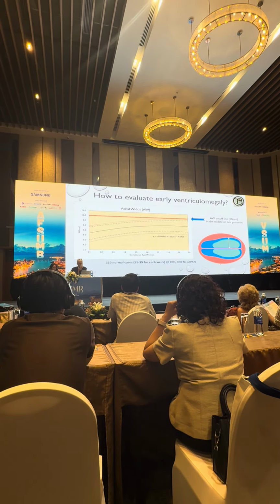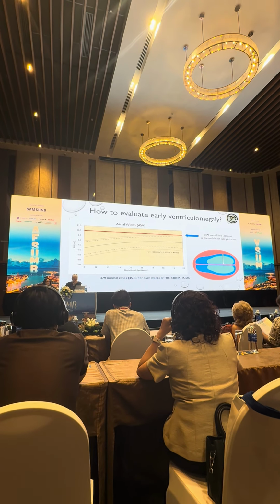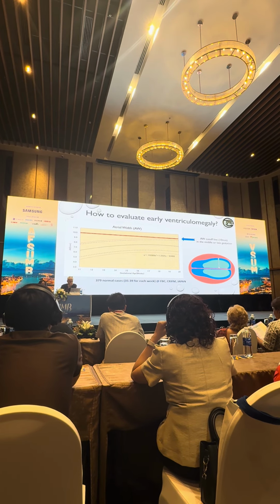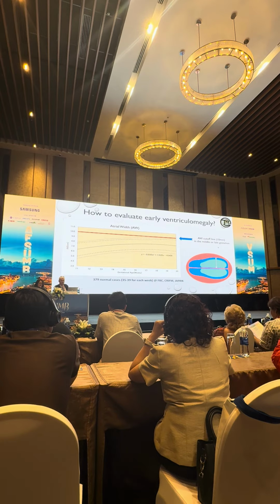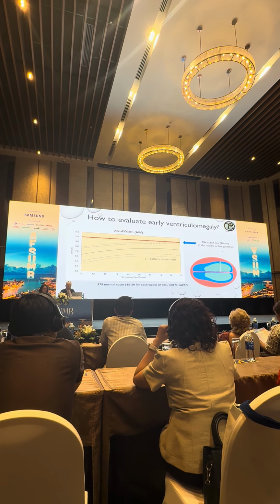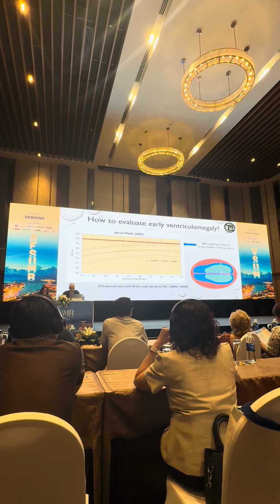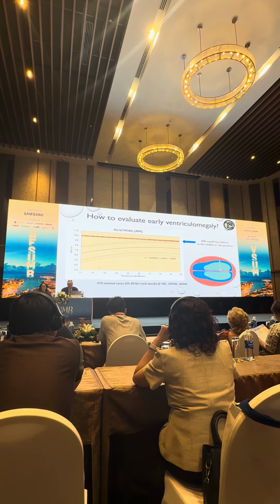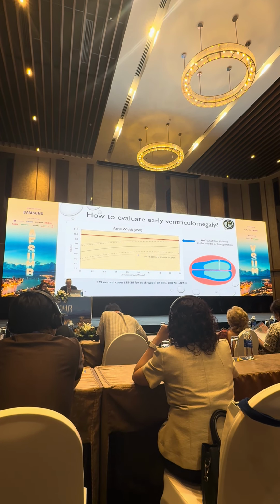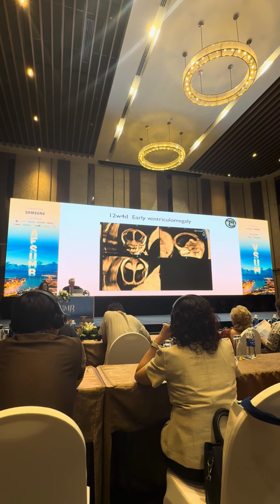The atrial width cutoff line is usually set at 10 millimeters. However, in a very small fetus, small brain, small head, the cutoff of 10 millimeters is useless, right?